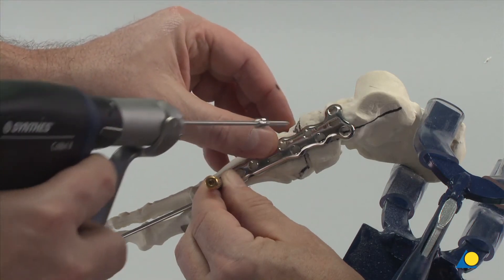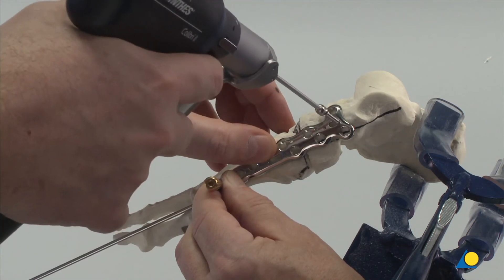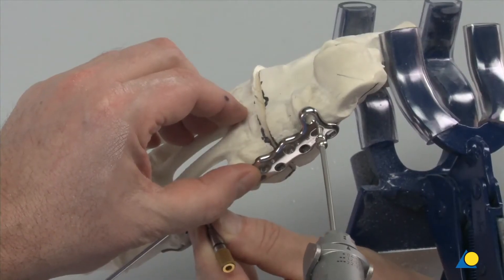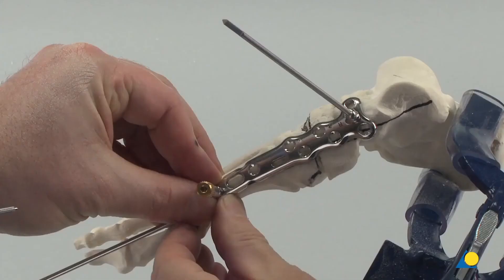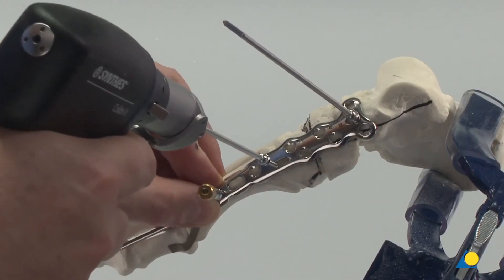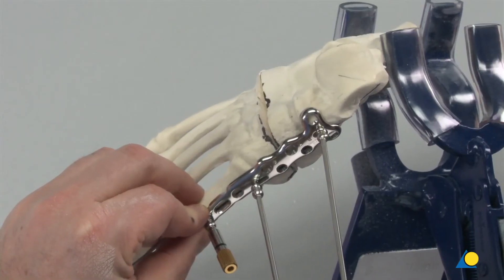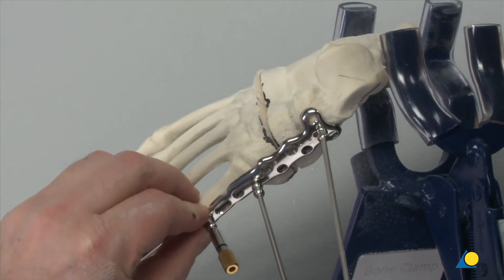The plate is provisionally secured with a 2.8 mm compression wire inserted through the compression slot in the talus part of the plate. The second compression wire is inserted through the compression slot in the cuneiform portion of the plate. To maximize compression, the wire is inserted as far distal as the anatomy permits.